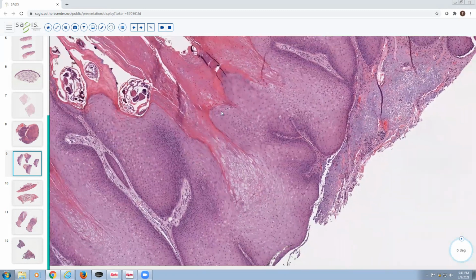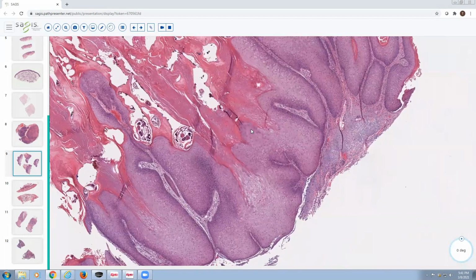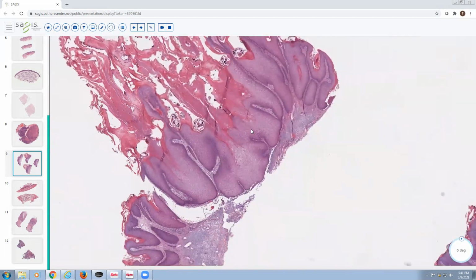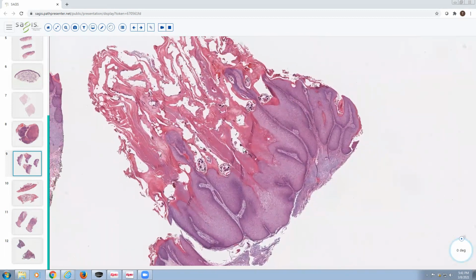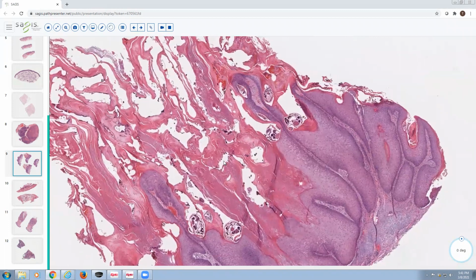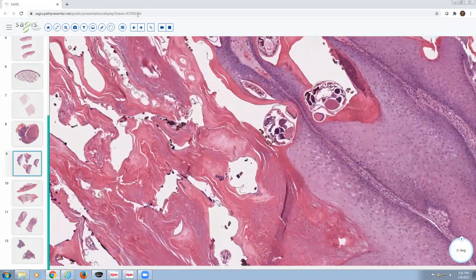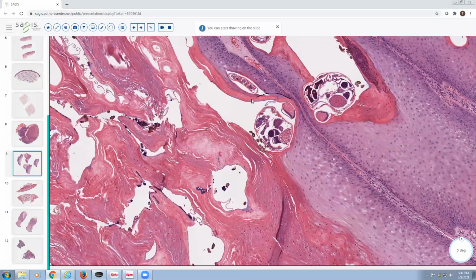And when you've got hyperkeratosis plus pseudoepitheliomatous hyperplasia, you want to think about a prurigo nodule, or even plaque of lichen simplex chronicus. And then what's kind of conspicuous here is in the cornified material, you've got mites. And the mites are pretty numerous here.